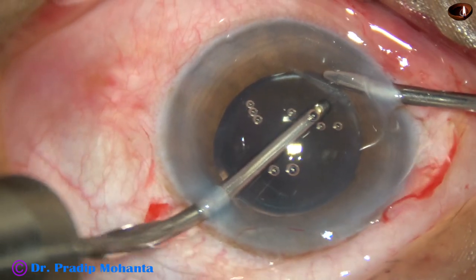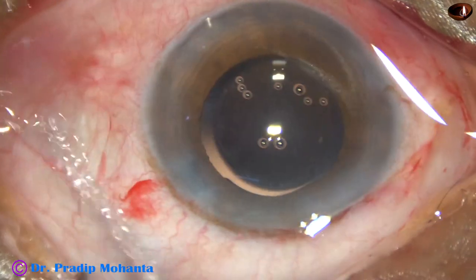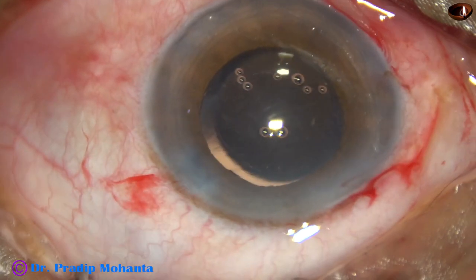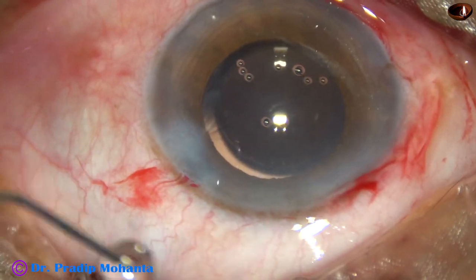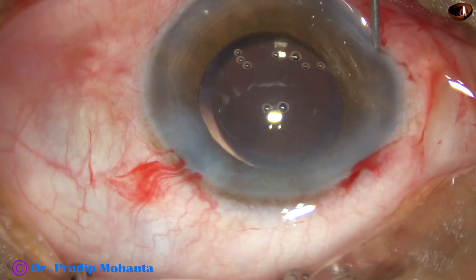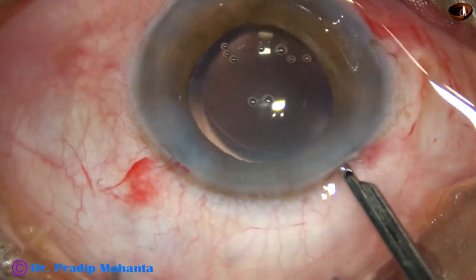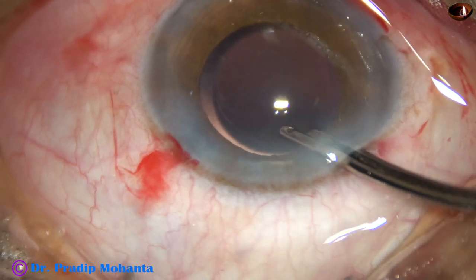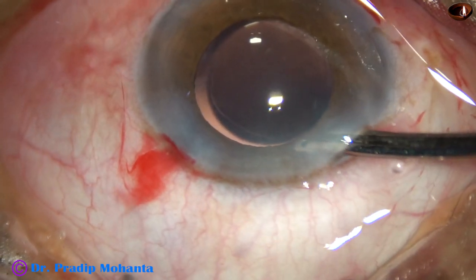There are some lens fibers at 8 o'clock that are being removed at this moment. In this video, what I want to stress upon is that some white cataracts may not require two-stage rhexis. As we incise the anterior capsule, if we notice that there is no positive pressure inside the lens, we can do rhexis on-the-go — but the rhexis should be about 5 mm in size, because if we plan a large rhexis and it runs to the periphery, it may be difficult to bring it back.